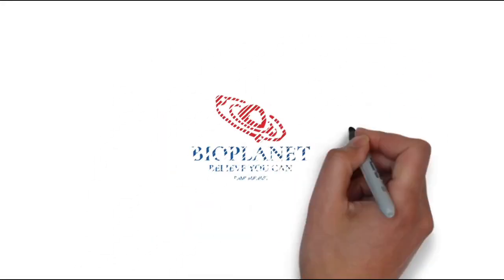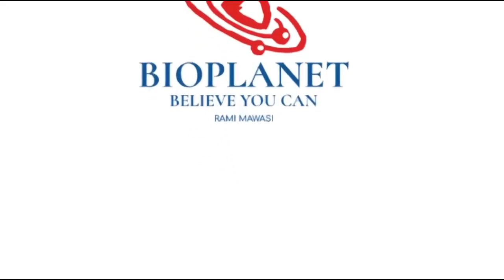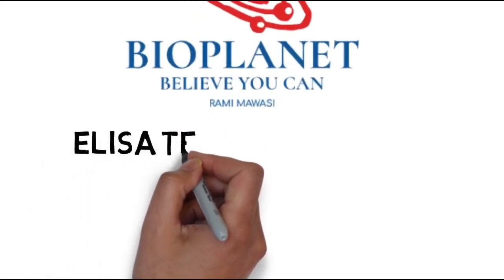This video explains the steps of the ELISA test and its uses.